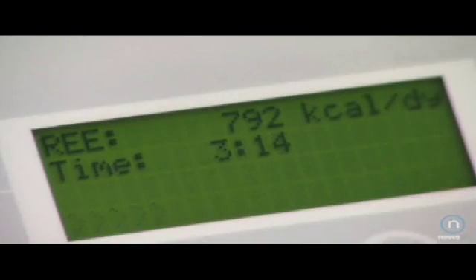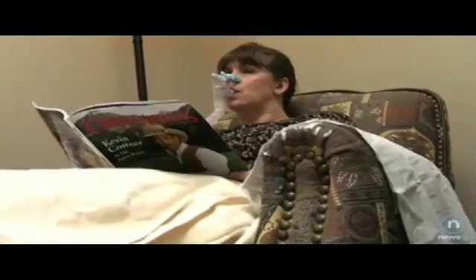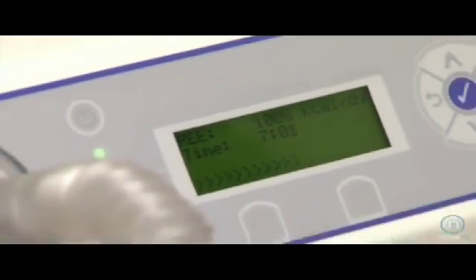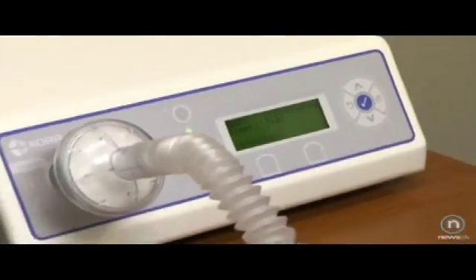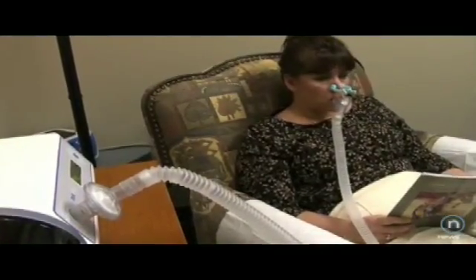That is so interesting — just by breathing into this machine it can actually calculate and tell where that person's metabolism is, because obviously every person's metabolism is different, right? Exactly. It measures oxygen exchange, and the amount of oxygen you take in directly relates to how many calories we burn.